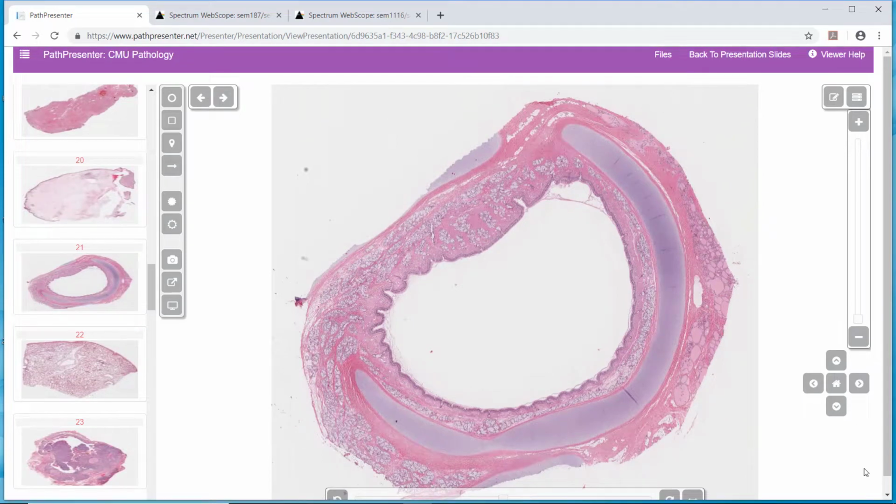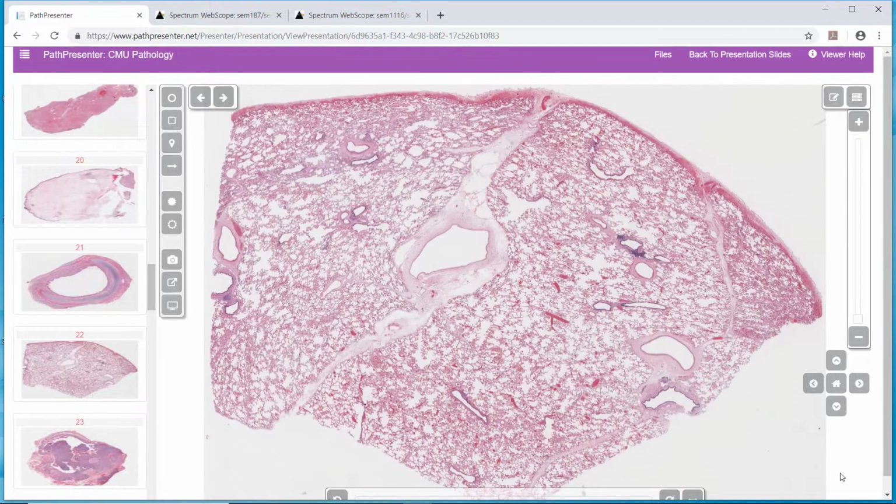This is the slide review for the lung tumors and pleural tumors. Slide 21 is the trachea. There is a separate video that reviews this slide. Slide 22 is normal lung. There is a separate video that reviews this slide.